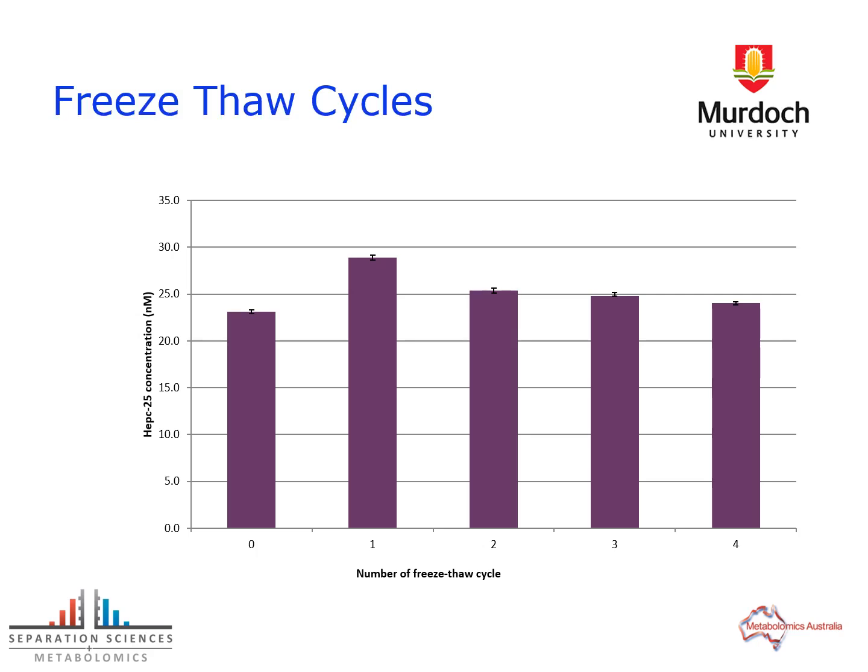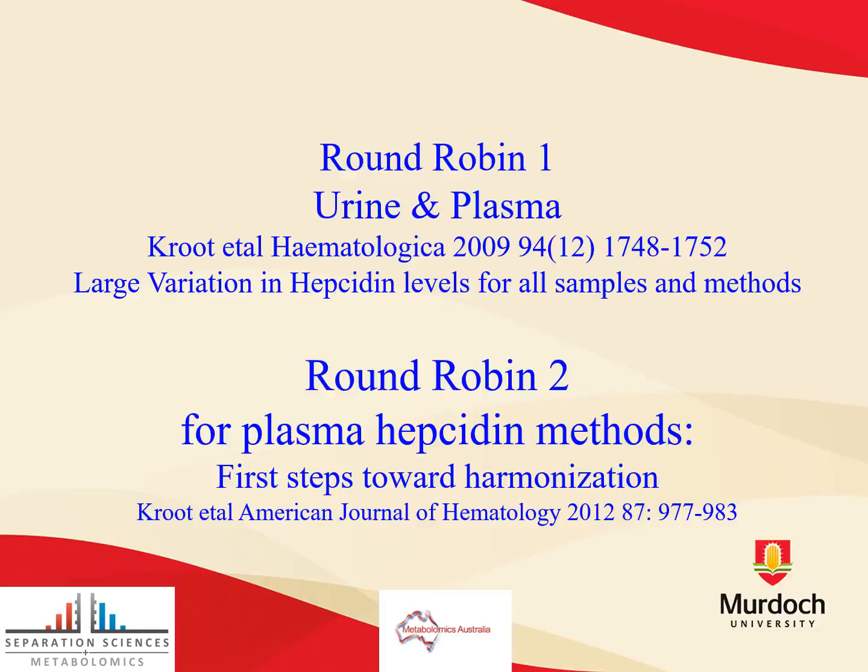And it's also true to say that subsequent freeze thaw steps reduce the levels that were measured. And this is just a good indication: if we're going to do big studies, we need to make sure that we aliquot out the amount required for each of the assays so that samples go through identical numbers of freeze thaw steps.